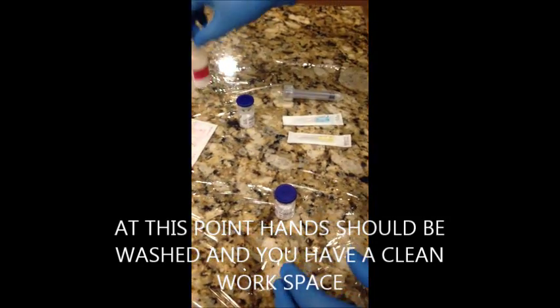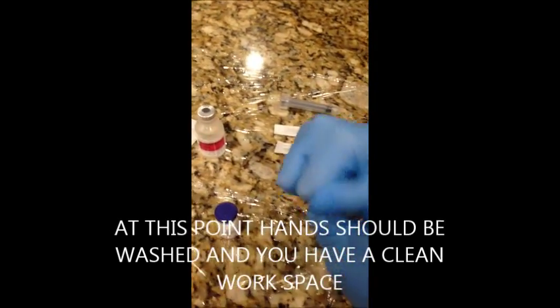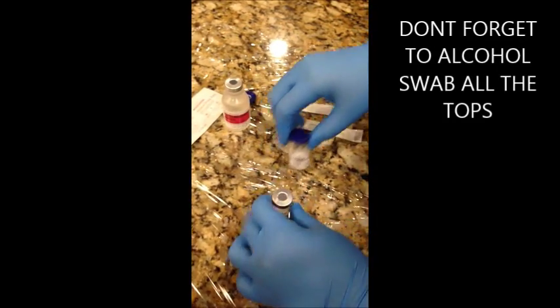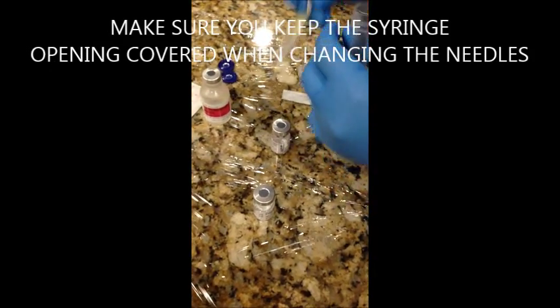Okay, the leucine shot — you're going to be mixing it with the water that's provided with you for this dose. It's two ml, so one ml in each of these jars, and you can see there's a powder substance at the bottom. What we're going to do is take the bigger gauge needle.